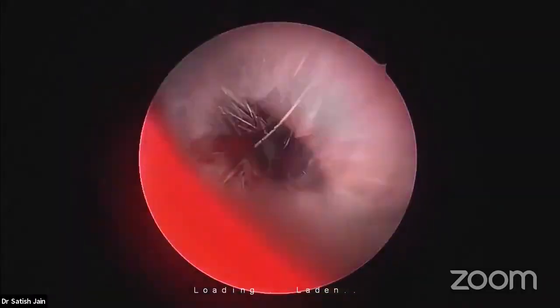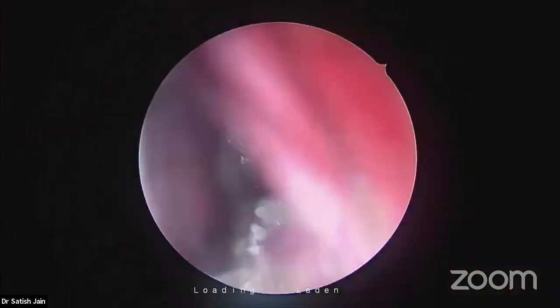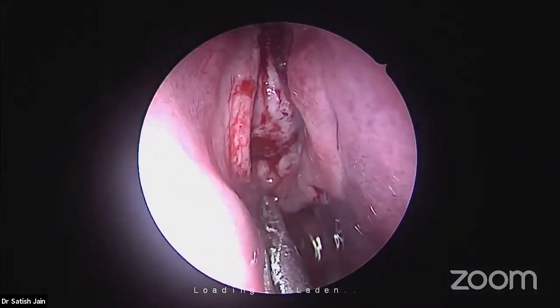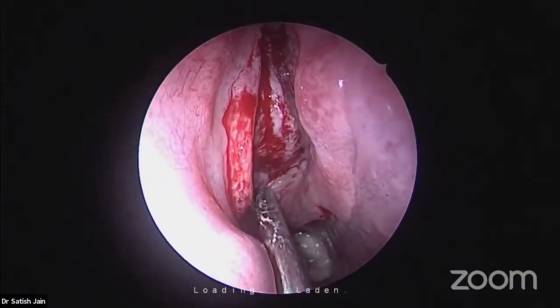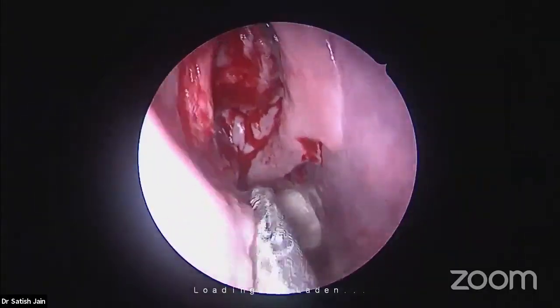Now see the field. Wash. Every time you can improve the field. It's bloodless, as well as you got more space to work also because of the decongestion. See this? Now, coming to the steps of the sinus surgery, I'm going to show only one side.